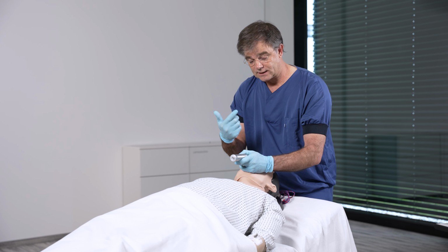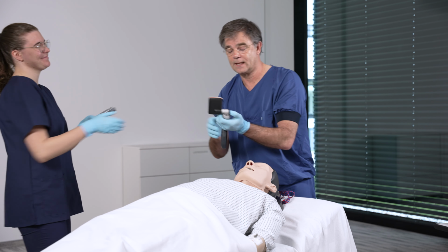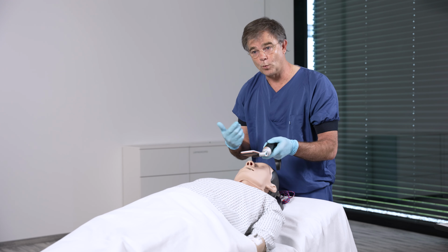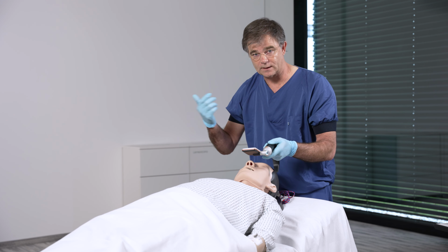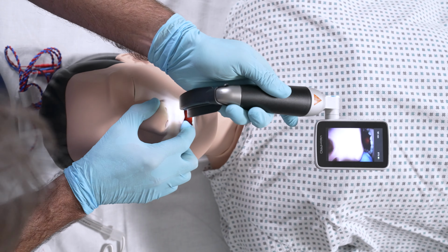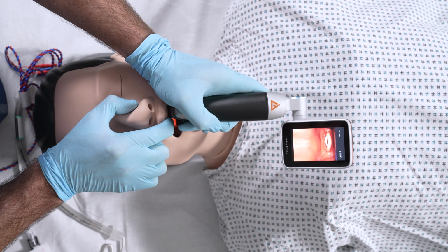If I exchange my laryngoscope for a video laryngoscope, thank you, I can use it and make this intubation a wee intubation. Everybody in the room, my assistant and even the surgeon, can see if intubation is done correctly. So I'll take the video laryngoscope, introduce it, and I'll get a nice view of the glottis.